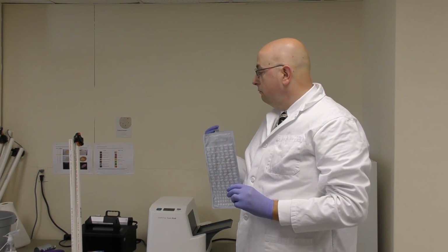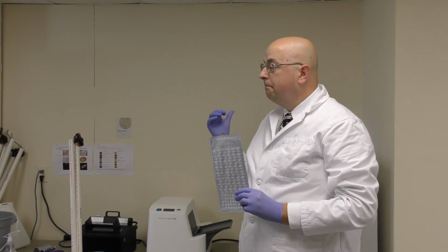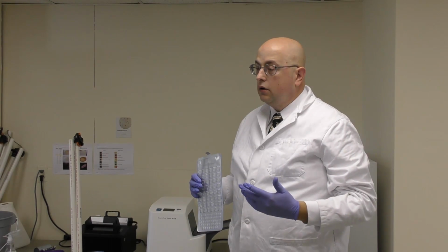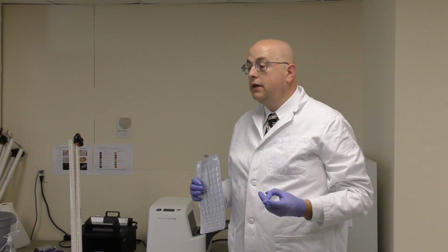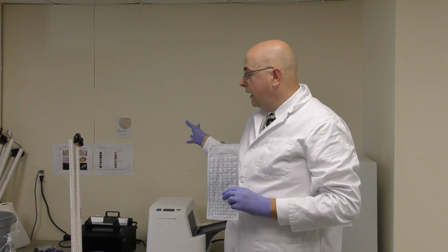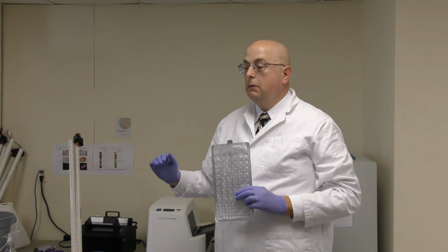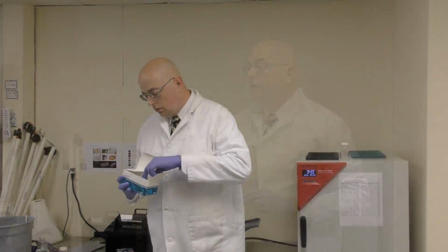And when we look underneath the comparator, we have a sample that's currently incubating right now. We'll pull that out later today. And we run it underneath the UV light, and you look at the color, it'll fluoresce, and it'll also have a yellow color. And if it possesses both of those traits, we would count that as an E. coli bacteria. And then you would use a quantity tray or a comparator chart, and based upon the number of large wells and small wells that give you a positive reaction, you get a value associated with it.